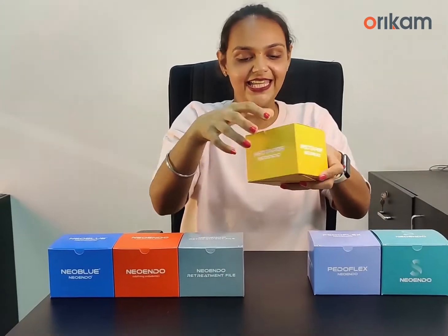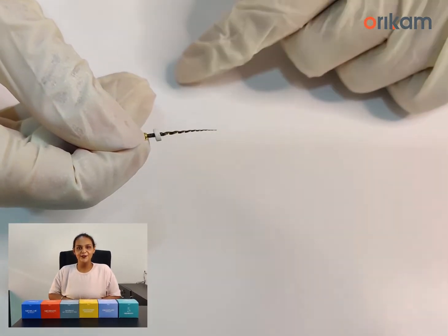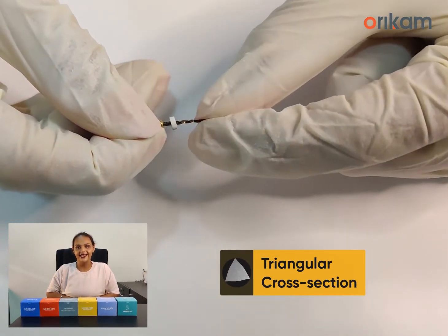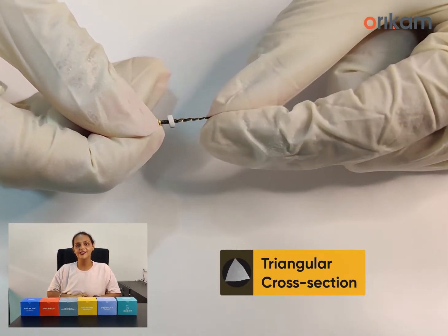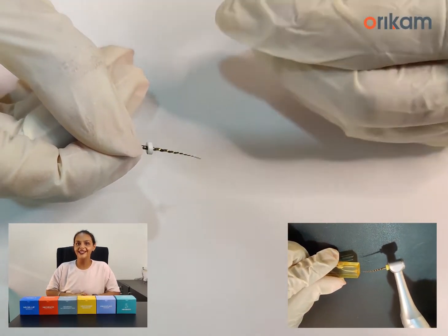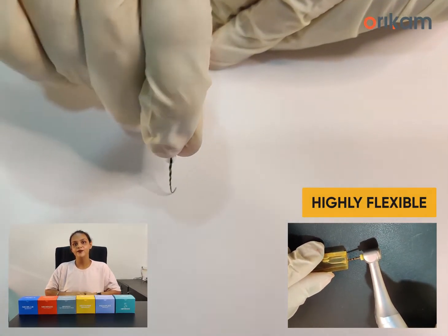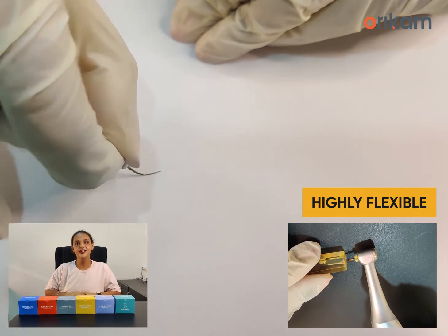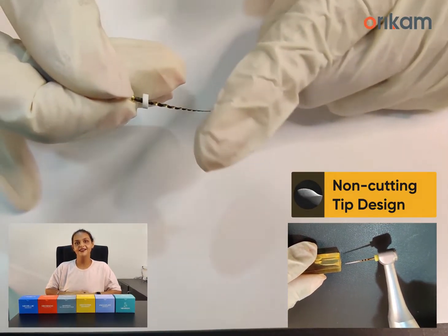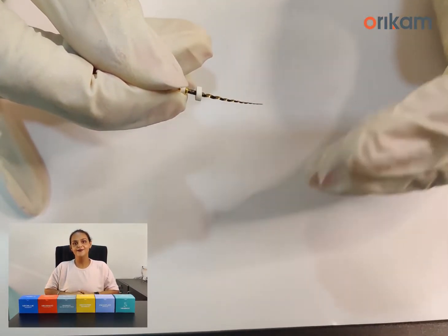This file is gaining popularity because of its simplicity. Coming to the features of NeoTaper, it has a triangular cross section and sharp cutting blades which increases the cutting efficiency of the file. This file has also been given heat treatment like Neoindo Flex, which provides it greater flexibility to navigate challenging curves of the root canal system. Its non-cutting tip design allows it to safely progress through the canal wall and minimizes the risk of ledge formation.